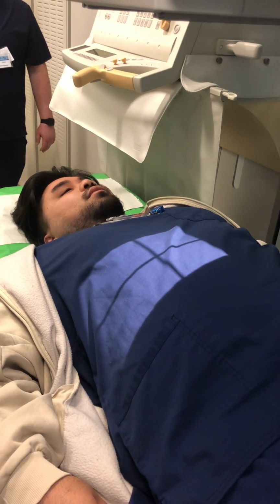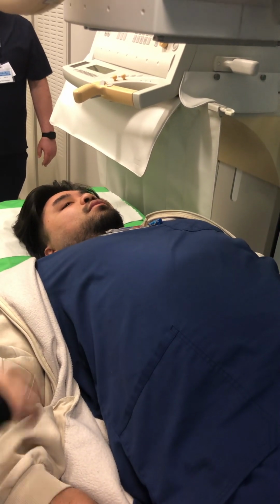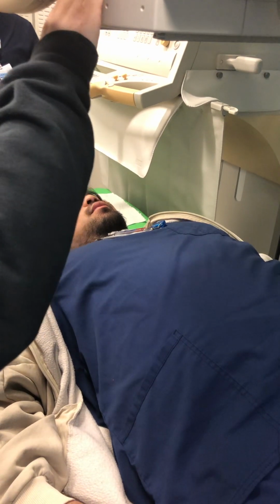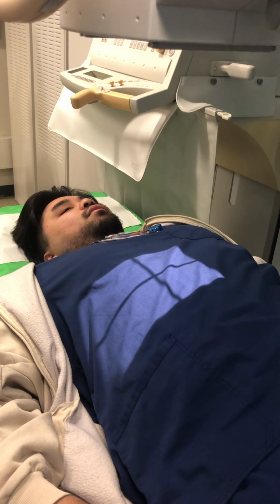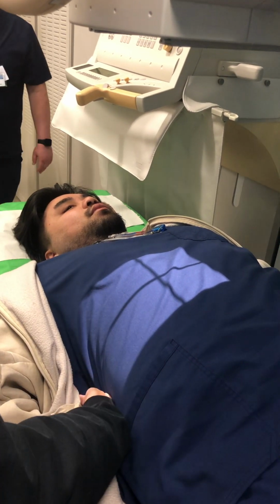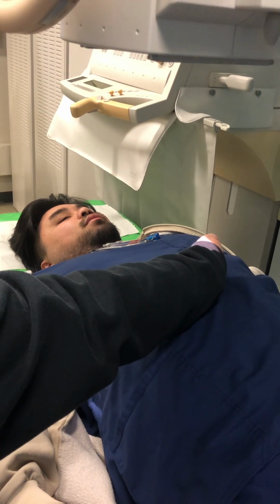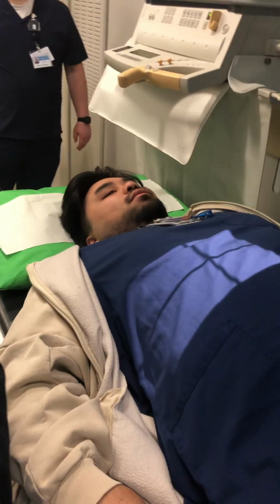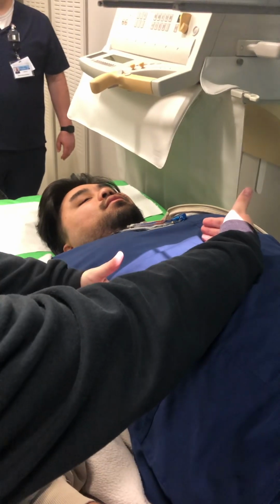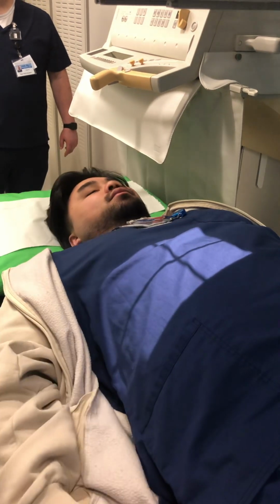So, remember, we're going to do this on expiration. So take a deep breath in, blow it all the way out, and then take your picture. Your light should be a little past the lower costal margin, just in case, because I also have plenty of room to the spine. So possibly the lateral skin margins to the spine would be a good judge.